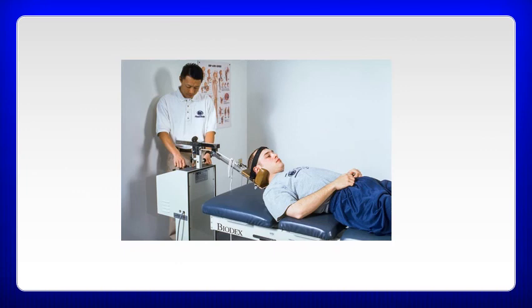And again, these are just some more pictures. So here again, you see someone getting some mechanical cervical traction. So you can see that little pad right on the bed. You want this right tight to the occiput so that when it pulls, you're not getting any sliding. So this is a pretty snug fit in and around here. And again, here's where you would set all of your parameters: on, off, time, sustain, intermittent, how much force you want to apply, what have you.